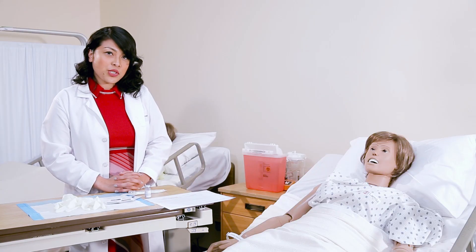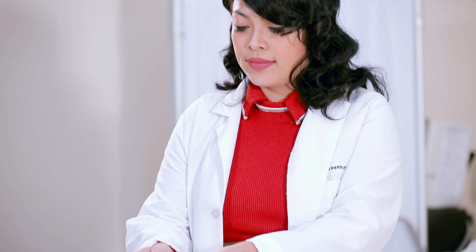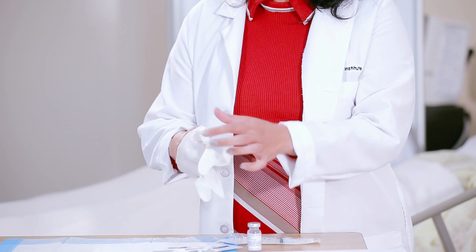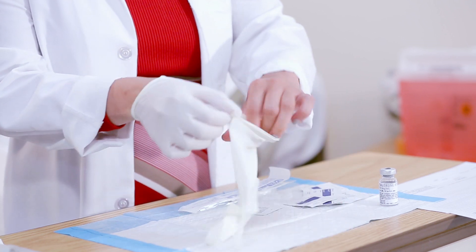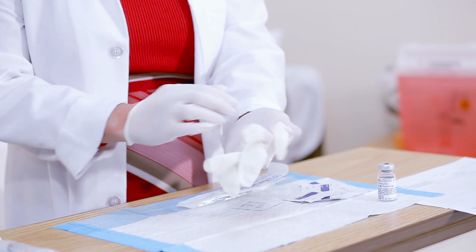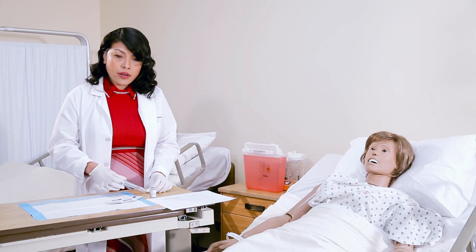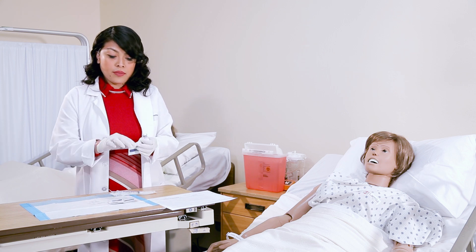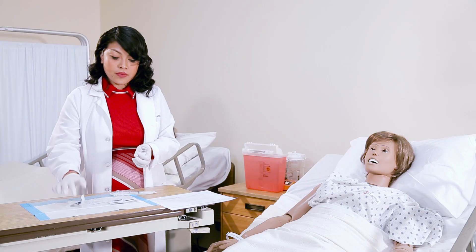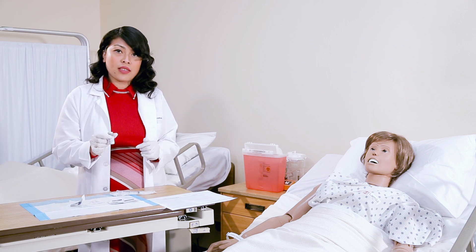Before you start the procedure, make sure you've washed your hands for about one minute and then you can apply your gloves. From there, you want to go ahead and clean the vial with an alcohol wipe. Again, you have to double check to make sure that you have the same medication that's matched onto the MAR.